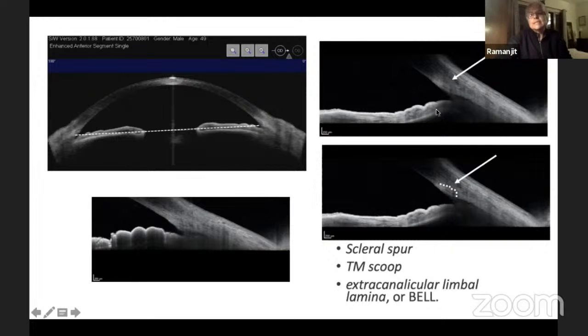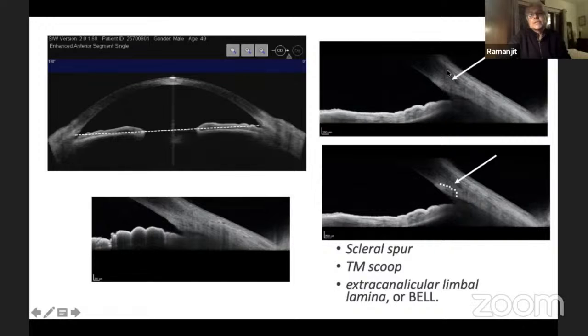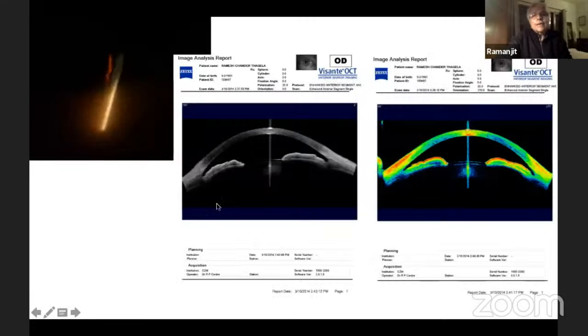And exactly what he said is, you can see the last roll of the iris, the ciliary body, and then you start to see the posterior trabecular meshwork, anterior trabecular meshwork, and the Schwalbe's line. So if we are looking at a narrow angle, and this is what we would say is a narrow angle, this is what we can see clinically.